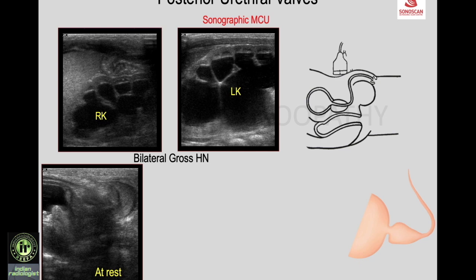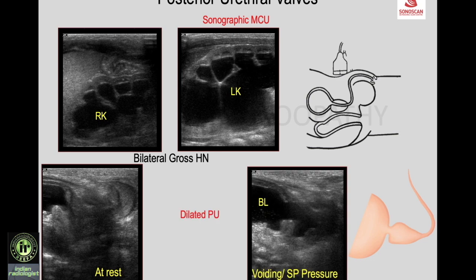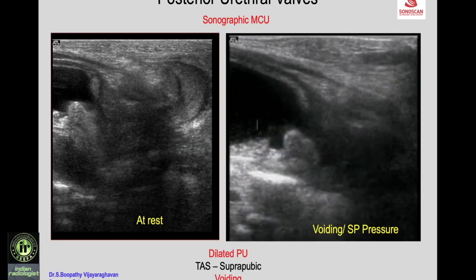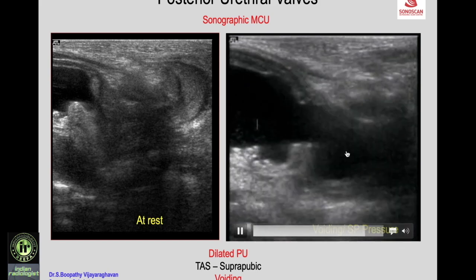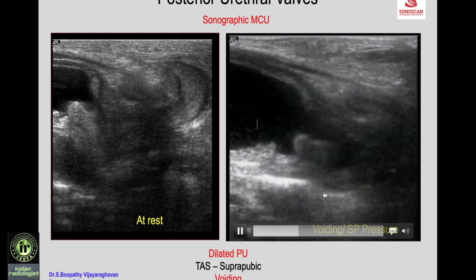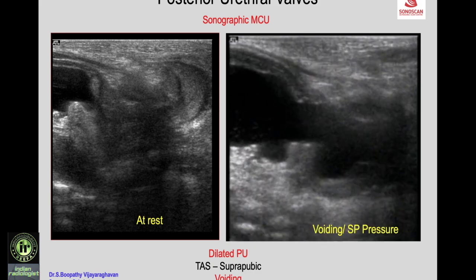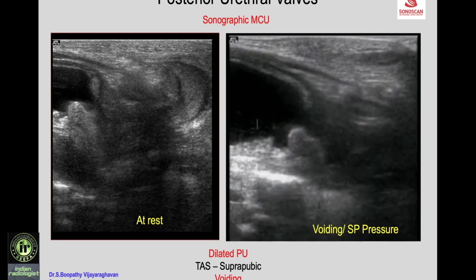With voiding or suprapubic pressure, the posterior urethra dilates, confirming posterior urethral valves on transabdominal scan. A video demonstrates that at rest there is no dilated posterior urethra, but when the child voids, dilatation of the posterior urethra appears as a piriform cystic structure on the posterior aspect of the pubis.